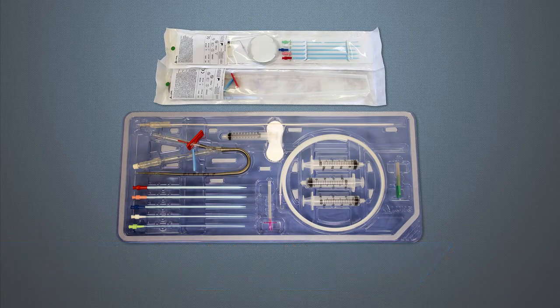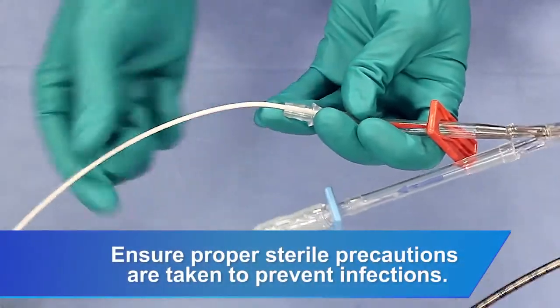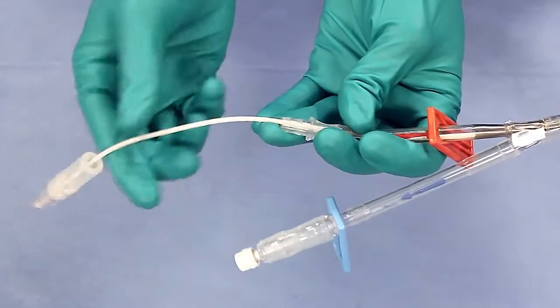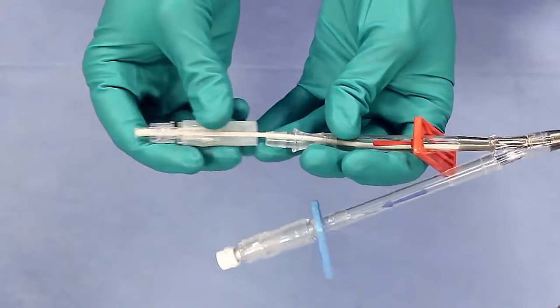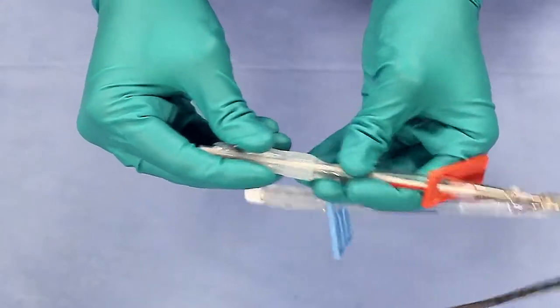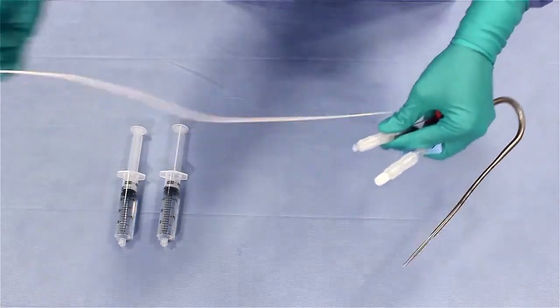First, open the Hemolung catheter kit tray. Using sterile technique, insert the stylet with priming adapter into the red infusion lumen. Remove the stylet, leaving the priming adapter in place.